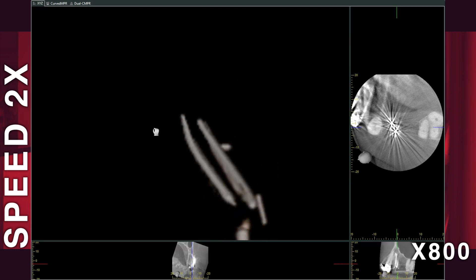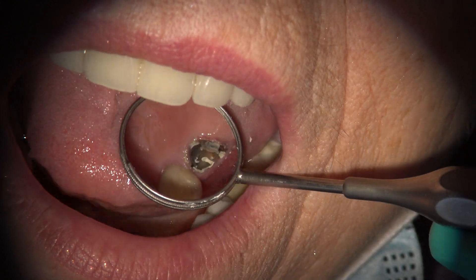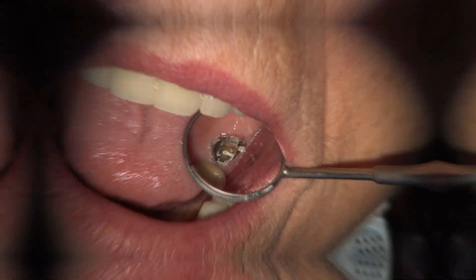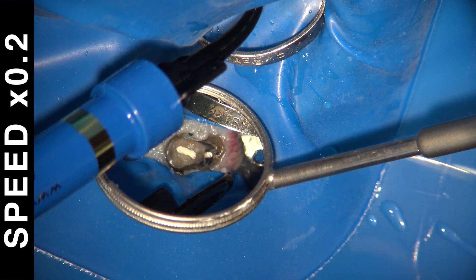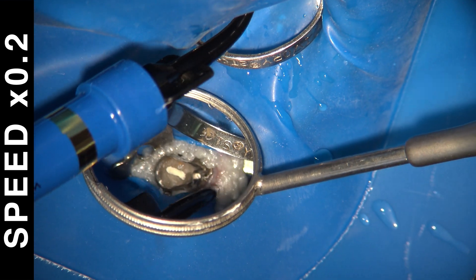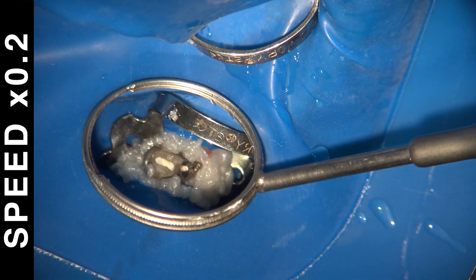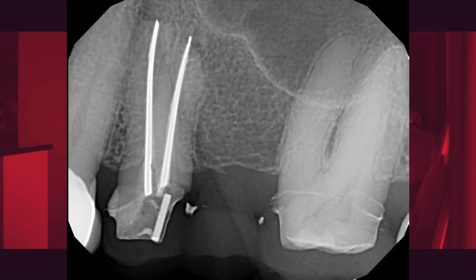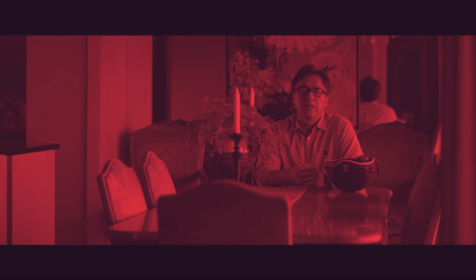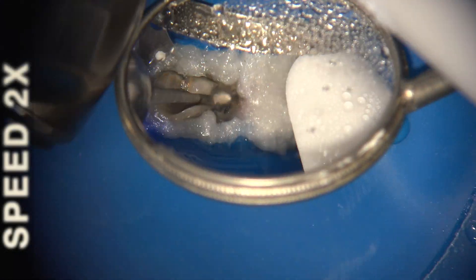After doing the access preparation, the entire buccal wall was gone and there was no distal tooth to clamp on to. I ended up finding a wide clamp, pushing slightly on the gingiva, and isolating the area with caulking material. Once the tooth was isolated, I removed some composite. There was also a pin in this tooth — I didn't want to remove the pin because sealing that hole would be difficult, and it hadn't caused any cracks or problems. With limited access, I could now see both the buccal silver point and the palatal silver point.